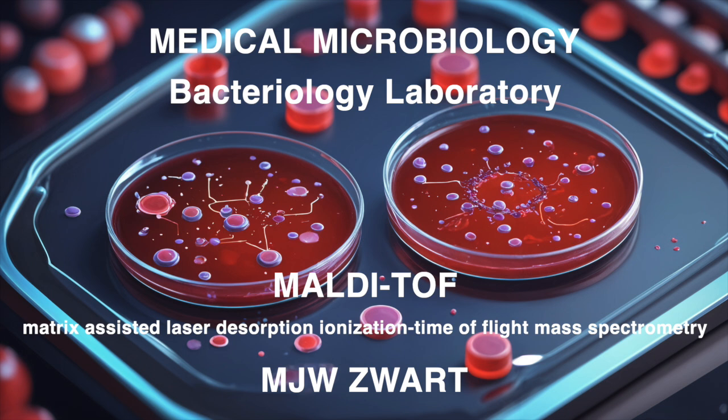Last case, Case 5. You're all set to run some samples, but the validation process fails. What do you do? Back to the drawing board. What are the steps? First, you repeat the validation.